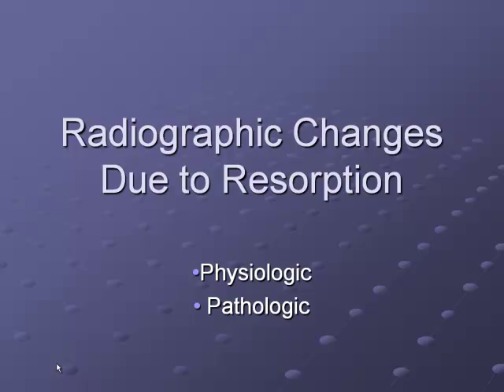Next, we will discuss radiographic changes due to resorption on page 297 in your text. The two types of radiographic changes due to resorption are natural physiological resorption, in which primary tooth roots are resorbed due to permanent teeth erupting, or a pathological change due to resorption from infection, trauma, or another unusual condition.